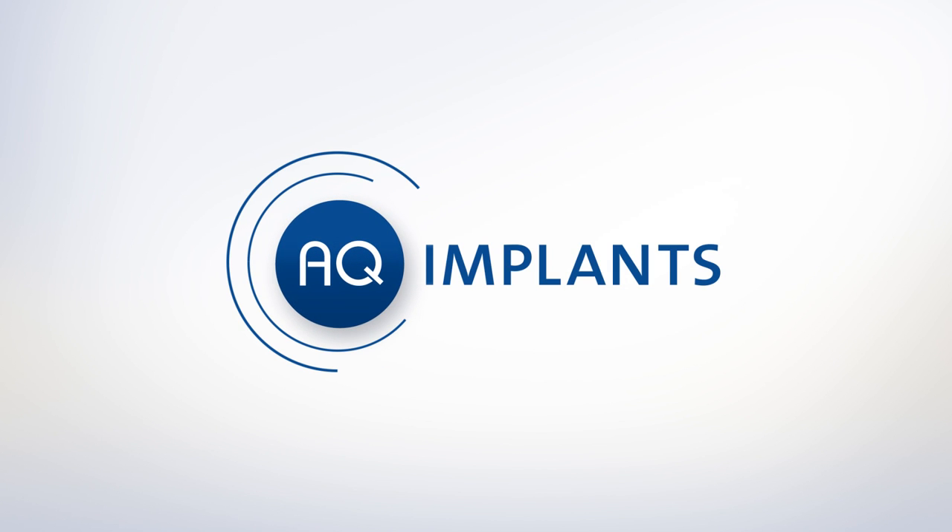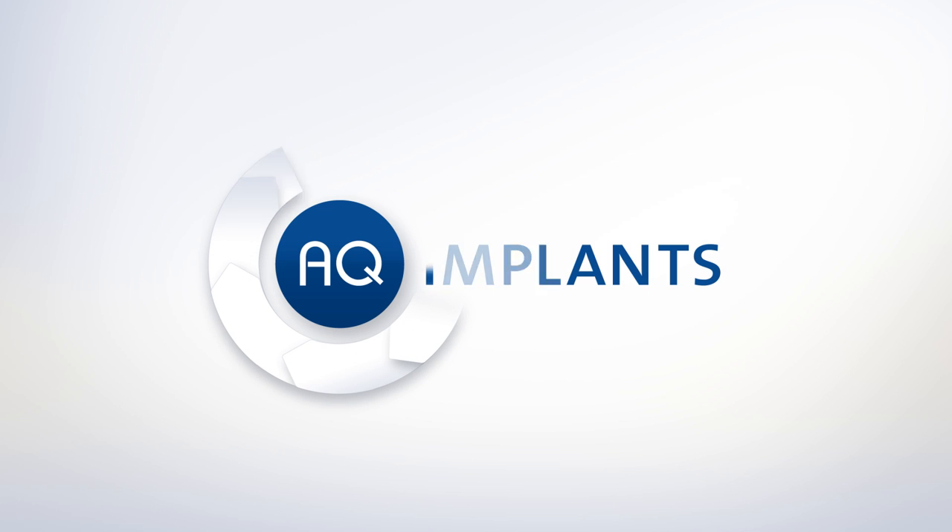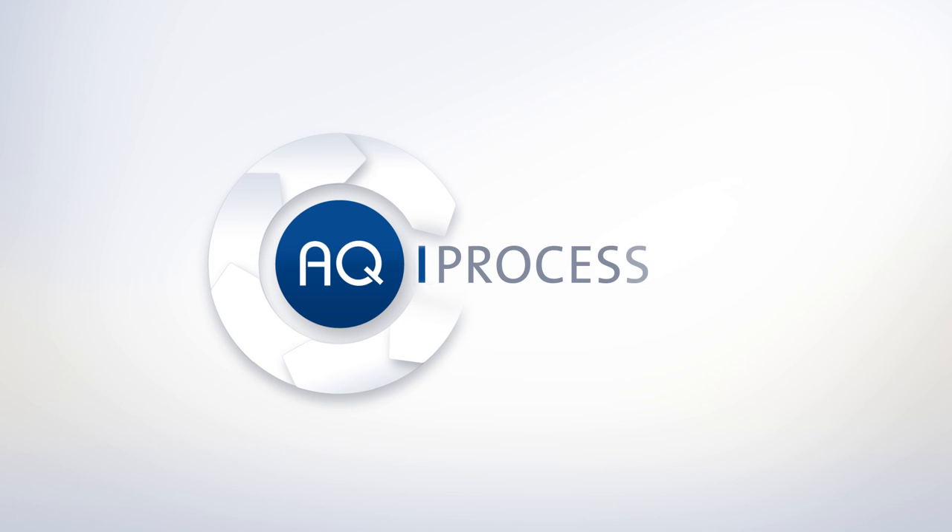In order to achieve a best possible outcome for your individual hip joint, AQ Implants has developed a specific planning and construction process. The AQI process comprises six steps.